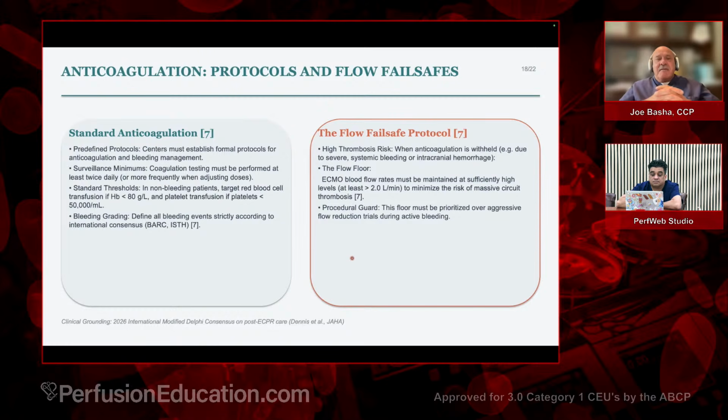Standard anticoagulation: VA ECMO is far more difficult to manage than VV ECMO. We have done VA ECMO with very minimal to no anticoagulation, with only antiplatelet medications like Kengreal, and have had good results. But we just recently had a situation where we were not wanting to use a lot of anticoagulation, and we were cutting it really tight, and we ended up with thrombus in the entrance of the oxygenator. And then the next week we had thrombus in that same patient at the inlet of the centrifugal pump.